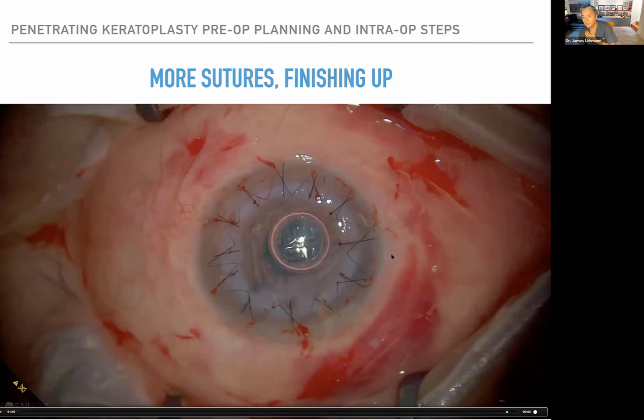Dr. Panagiotis George Godius asks, preferred time to trephine donor tissue, before host or after? Before, always before. An ideal distance of suture entry at donor site? You want to be, I would say, equal on these. You want to be about 2 millimeters, maybe 1.5 to 2 millimeters on each side.